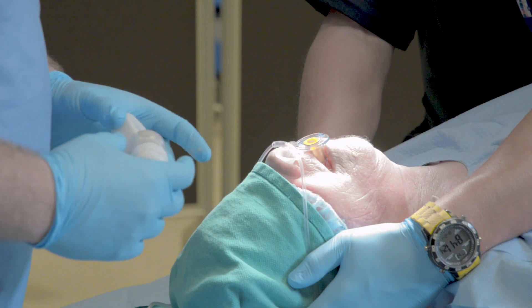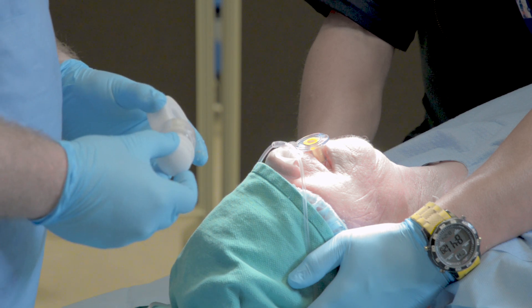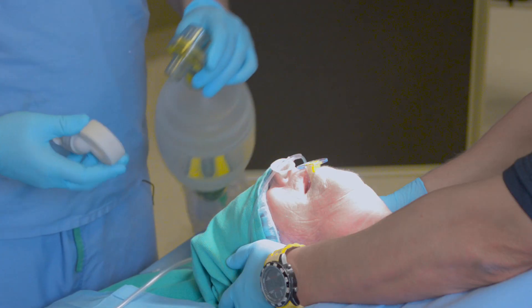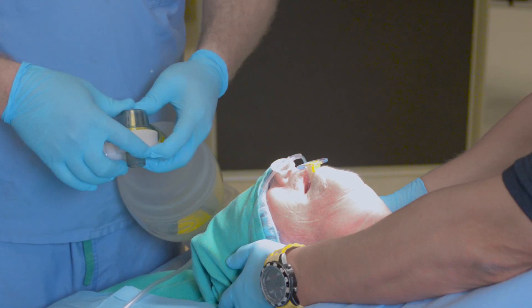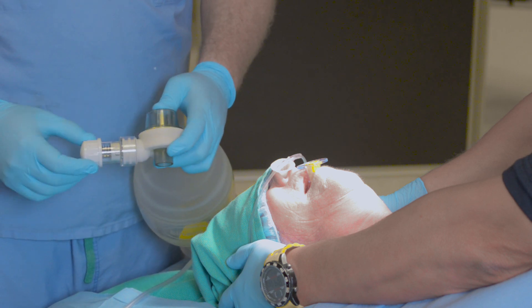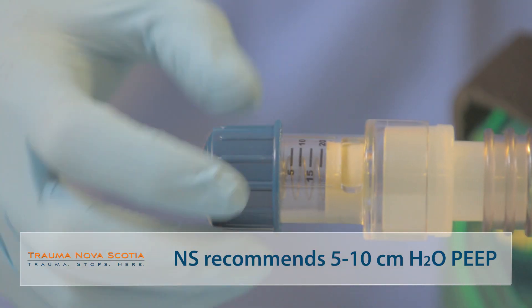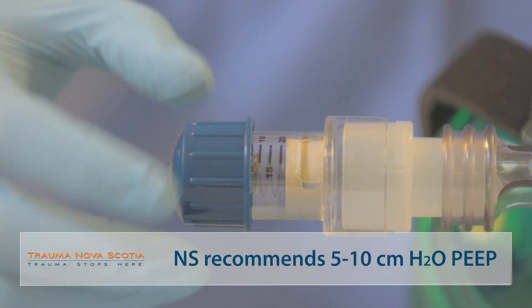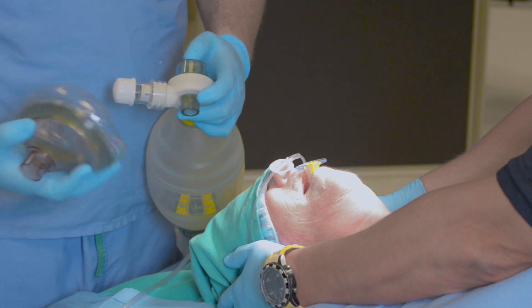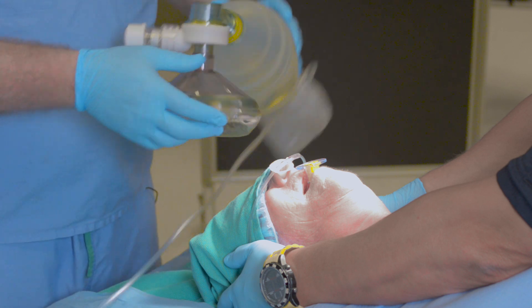The second type of obstruction is alveolar obstruction, managed with a disposable PEEP valve. The PEEP valve is connected to the bag mask ventilator device by snapping into place. On the side of the PEEP valve are gradations for how much PEEP you want to deliver to the patient, selected by simply turning the cap to the desired amount. Finally, a tight-fitting mask is attached to the bag mask ventilator and placed on the patient.